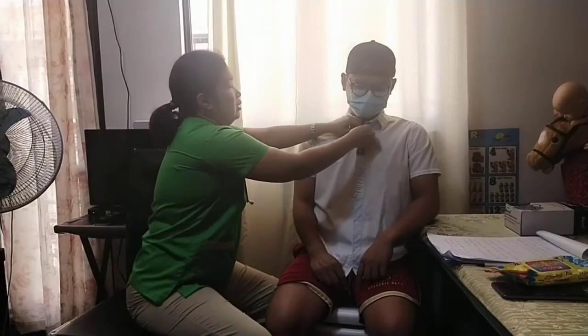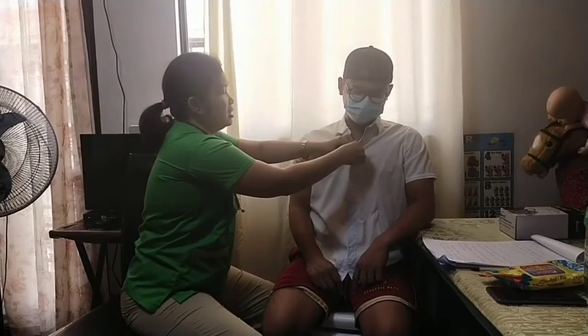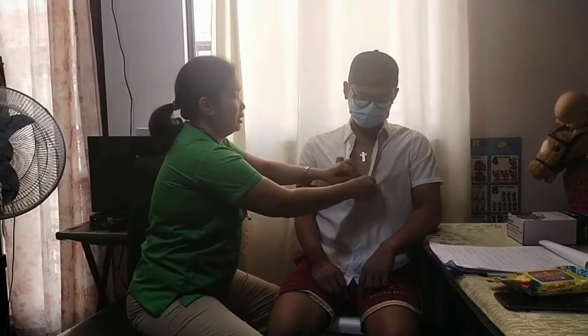Position the client in a comfortable sitting position or a supine position. Expose the area of the chest over the apex of the heart.